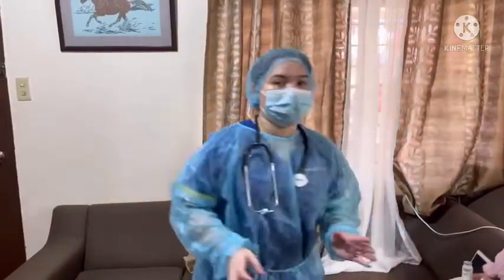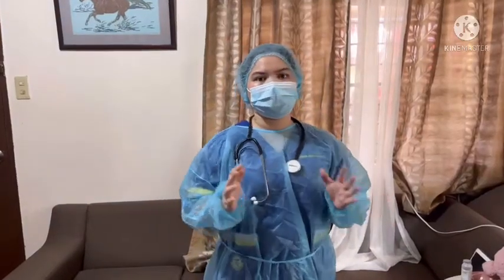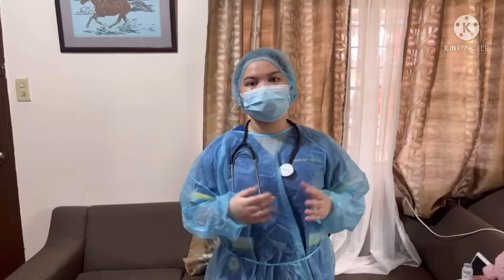After gathering all the supplies, check the client's record and the doctor's order to make sure that we have the right patient and the right procedure. So let's start.